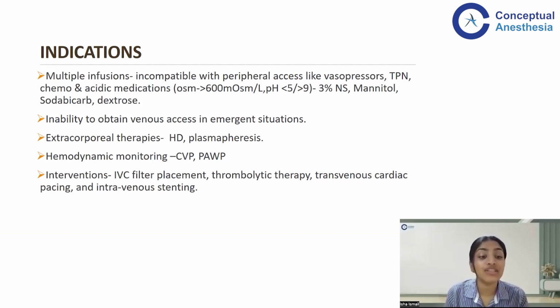Also, for administration of extracorporeal therapies, this is your hemodialysis as well as plasmapheresis. For hemodynamic monitoring of your static parameters like central venous pressure as well as pulmonary artery wedge pressure, and also for interventions like IVC filter placement, thrombolytic therapy, and cardiac pacing, which is temporary initially. All of these will require a central venous catheter.